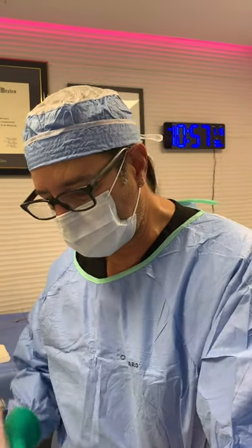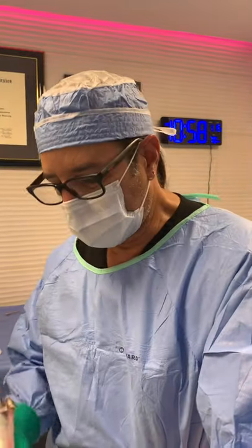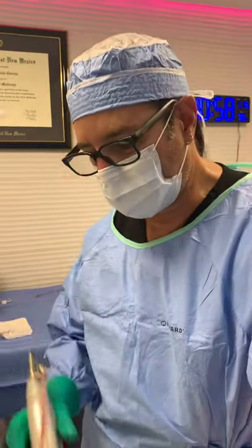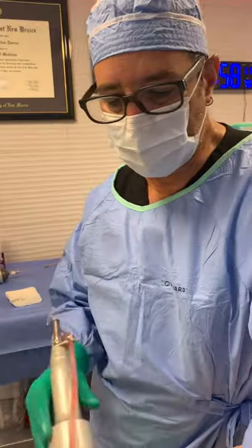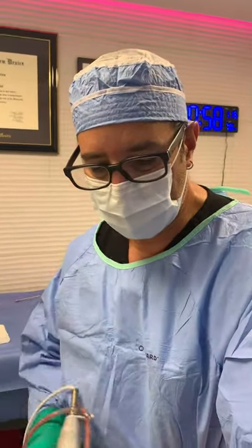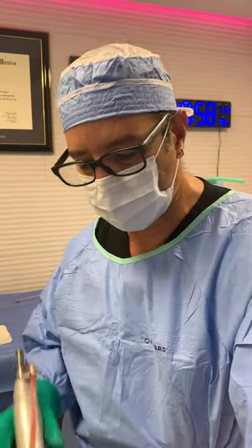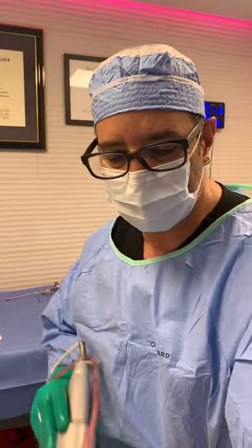And we're having a good time in the operating room. The patient is awake, not feeling any pain. She's in zero pain right now. And we're just working away on her stomach and the front part of her, the entire area, right from the breasts all the way down to the pubic bone. We're gonna keep her nice and flat.